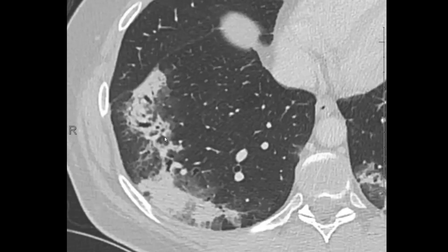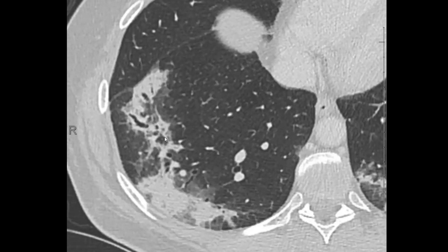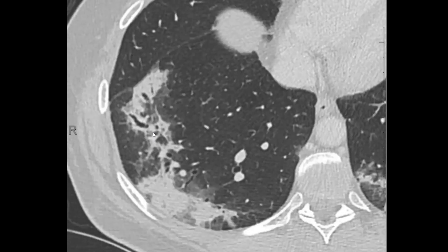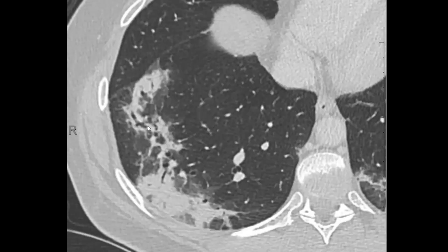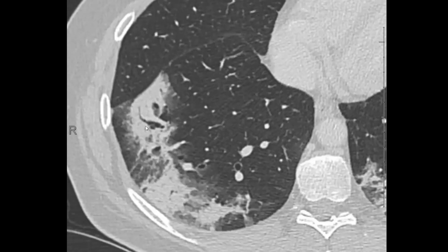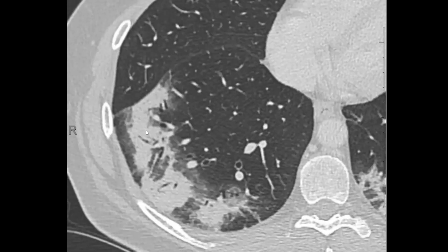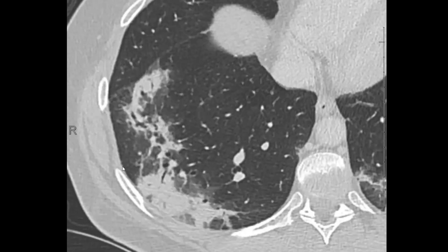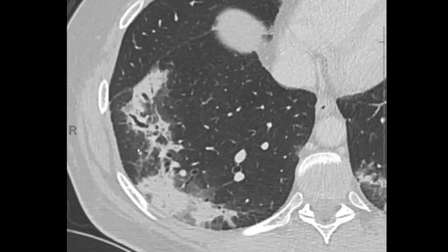Oftentimes organized pneumonia, when it's active, will give you these areas of bronchial dilation. It's actually probably not appropriate to call these areas traction bronchiectasis. I know that because we are dealing with a diffuse lung disease, there's a tendency to want to use that lexicon, and when you see bronchiectasis, you want to call it traction bronchiectasis.